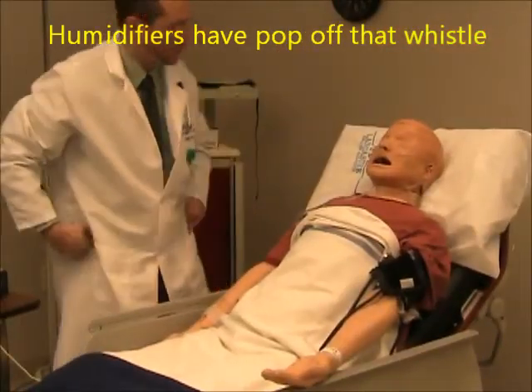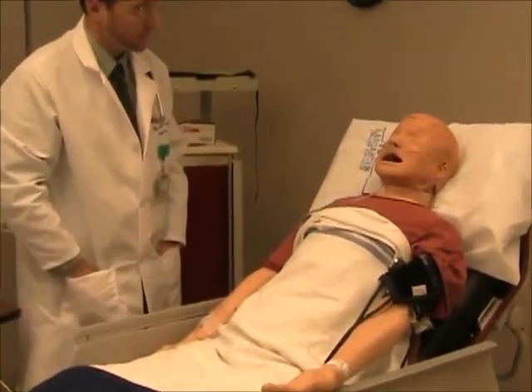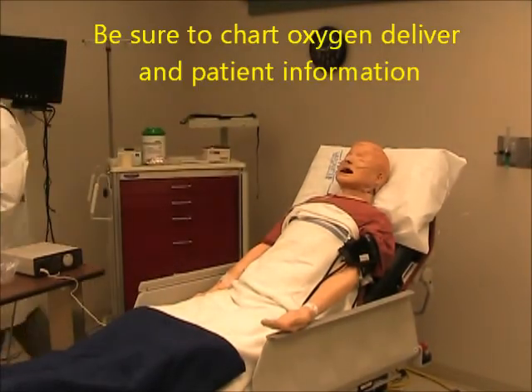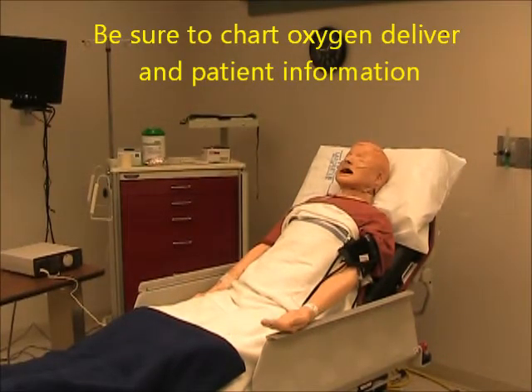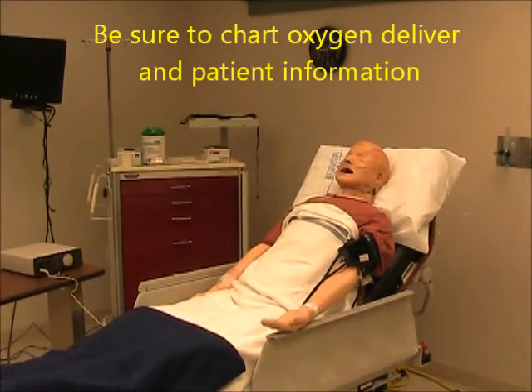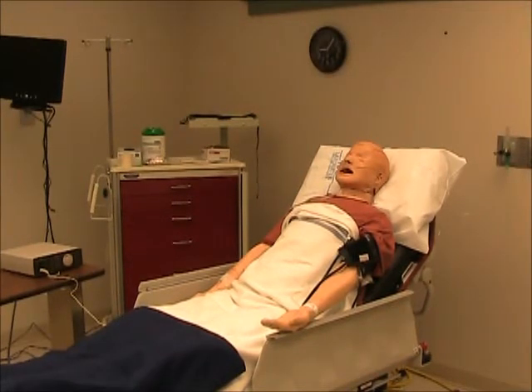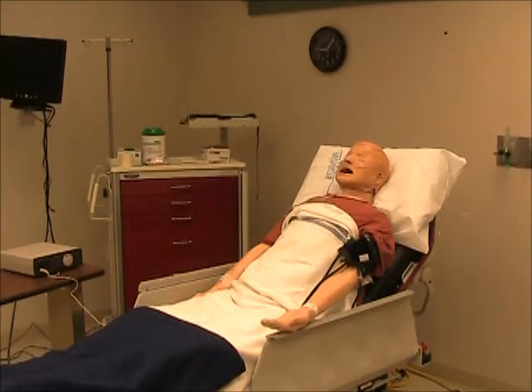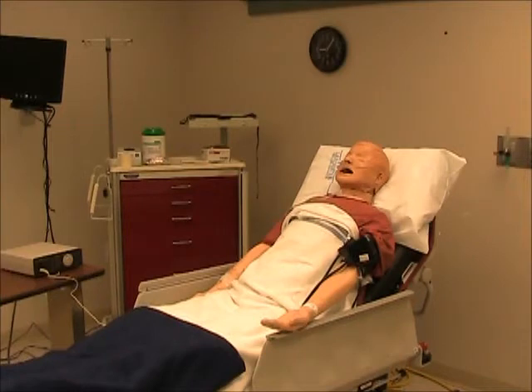Does that feel comfortable enough for you today? Excellent. Places the device properly on face, identifies that it's comfortably fit, confirms fit, and verifies patient's comfort. Assesses adequacy of therapy, and makes any necessary adjustments to flow rate.